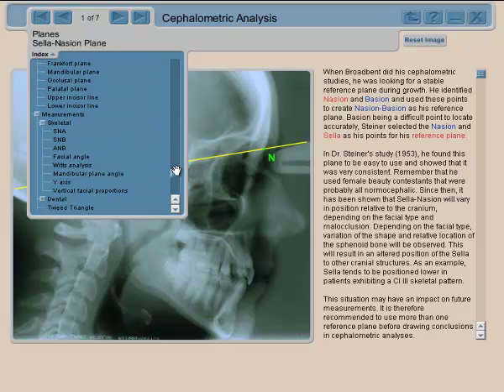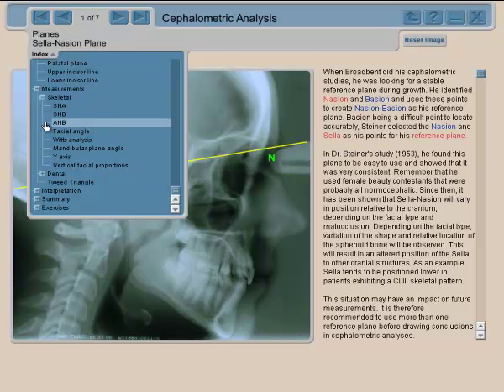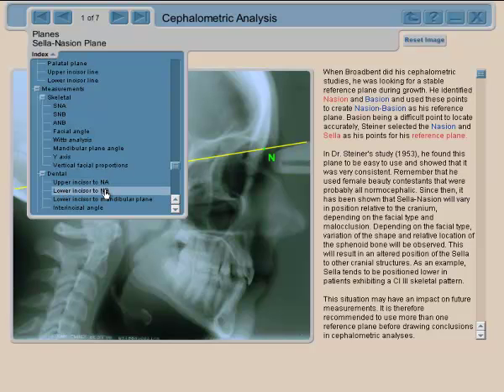Once we have the planes determined, we have the measurements. The main measurements are skeletal in nature — you measure the projections of the bony parts of the face. You also have some dental measurements where you look at the angulation and projection dimensions of tooth structures.